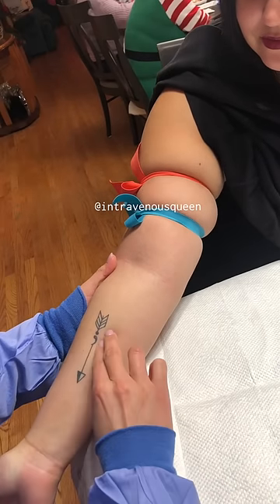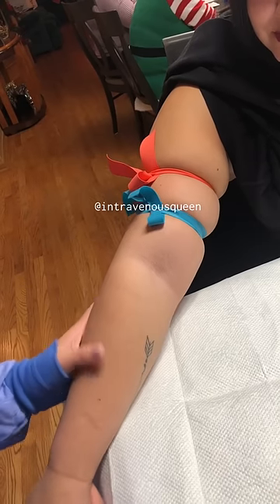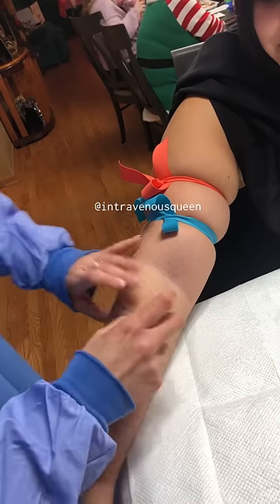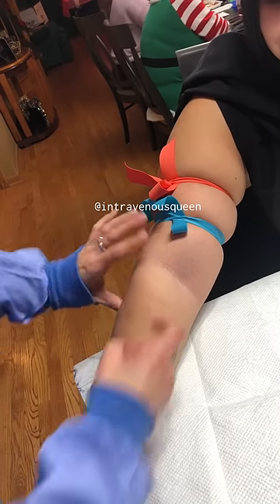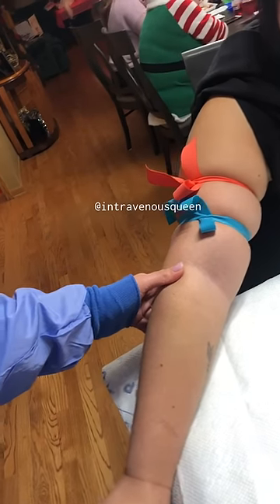I like to rubber tap veins, and I usually use some friction when I rub — this helps with warming up the veins. I don't recommend rubbing veins on skin with any rashes or skin that is heavily wrinkled, because you can actually cause a skin tear.